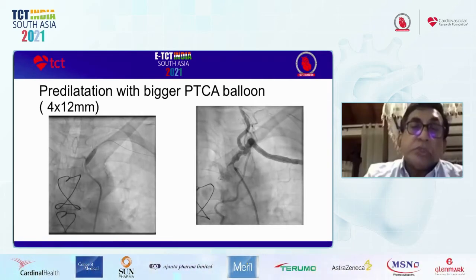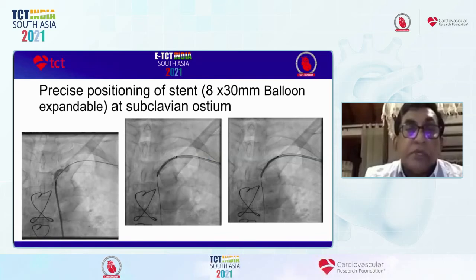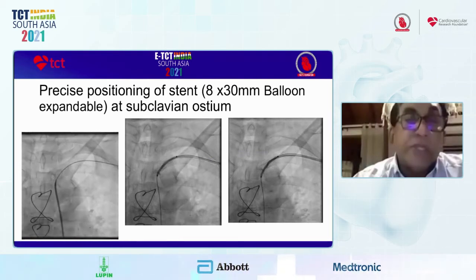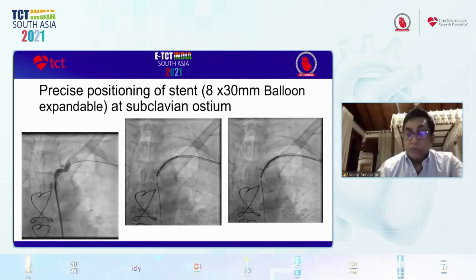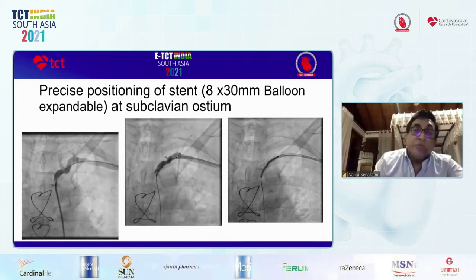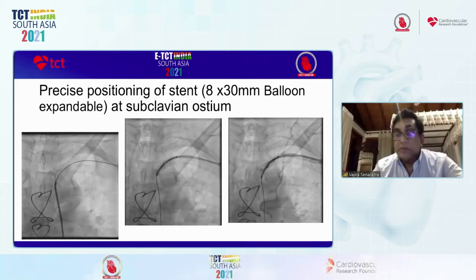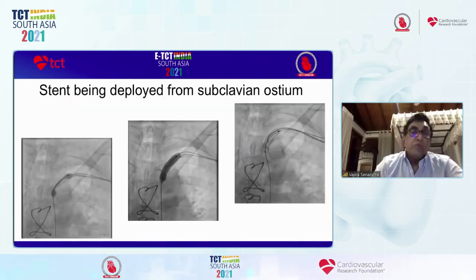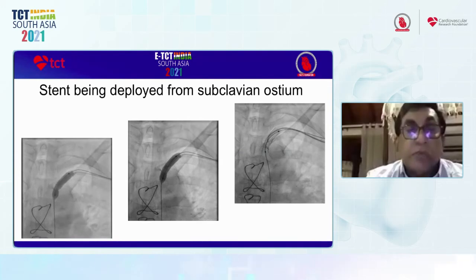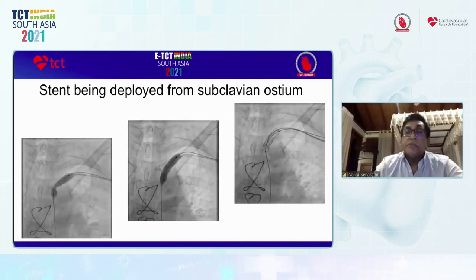Next, we decided to stent. As you know, the coronary guiding catheters won't take the peripheral stents. We had to go femoral because it would have been easier to go left radial, but the catheter won't take the stent, so we had to go for the femoral artery. I put the catheter to see the position of the ostium. We can't use a self-expanding stent at the ostium, so we used a balloon expandable stent. Now we inject from the catheter, and you can see it nicely covers the ostium. And then we deploy. It's a really tough lesion. It required a prolonged inflation for a while, and we finally opened up to normal levels. You can see now it's fully deployed and fully opened, and that is the picture after inflation.